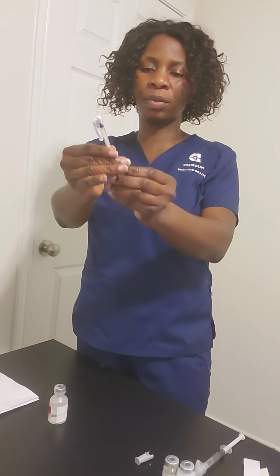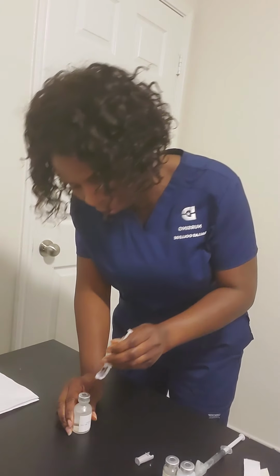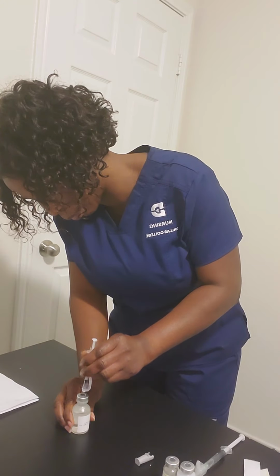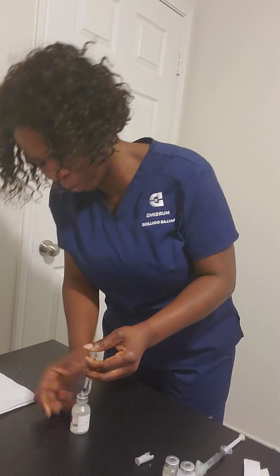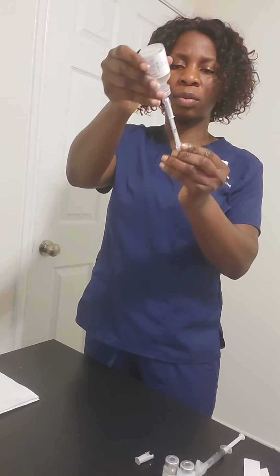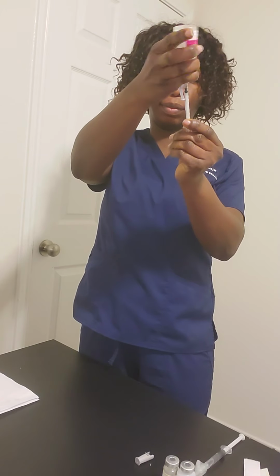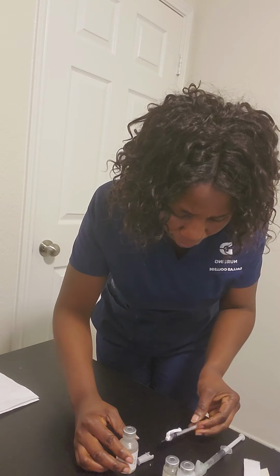So I'm going to draw 0.1 ml of air into the syringe, and I'm going to drop the air into my vial. So I'm going to be drawing 0.1 ml of PPD right here. 0.1 ml. And I'm going to be providing safety again by scooping.